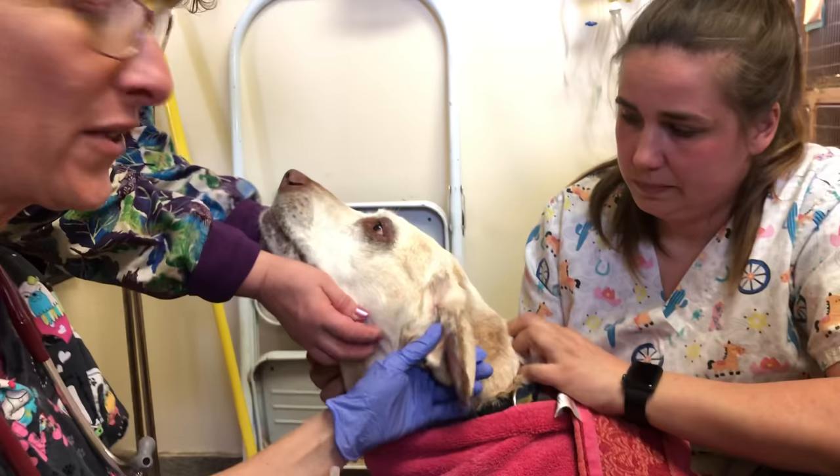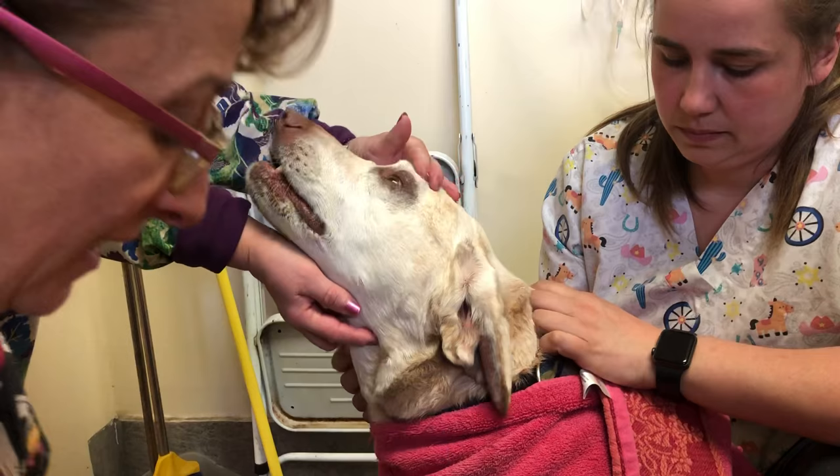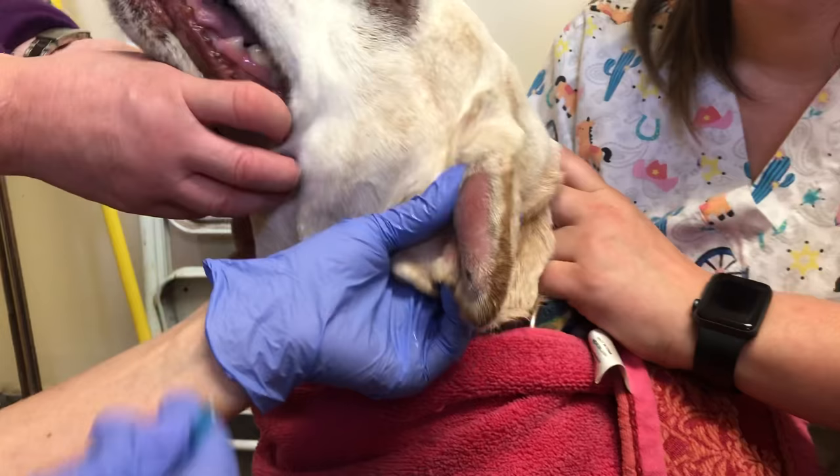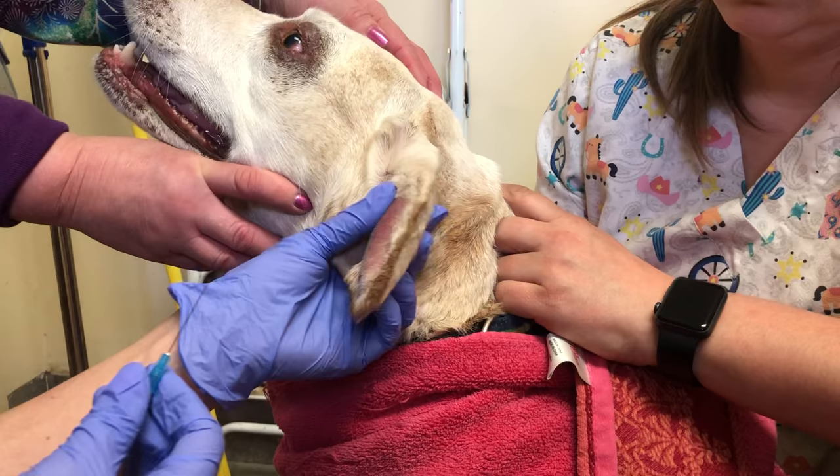She has a history of allergies, so you can see the hair loss around her eyes and the really thickened skin. She has what we call an ear hematoma — a big pocket of blood in between the lateral and the medial pinna. She's been shaking her head and busted the blood vessels in her ear, so we are going to put a drain in her ear.